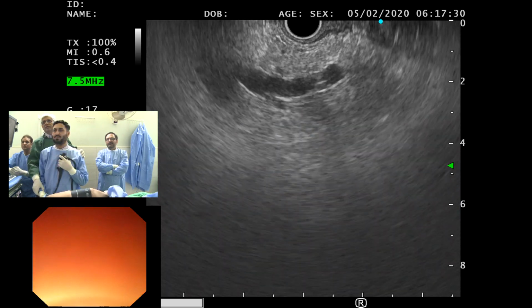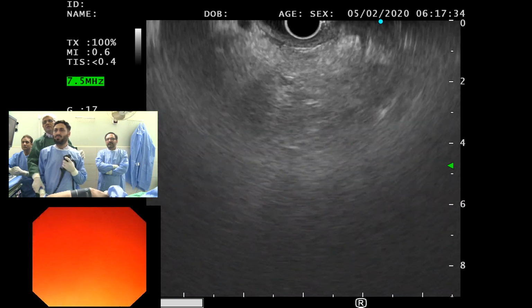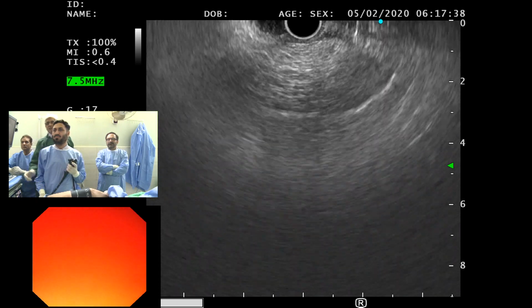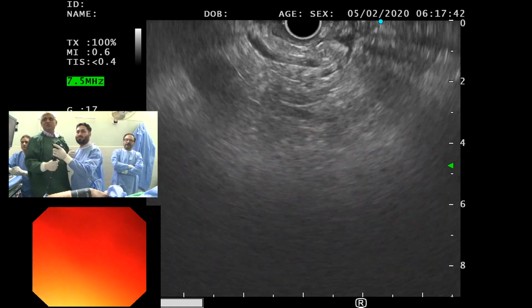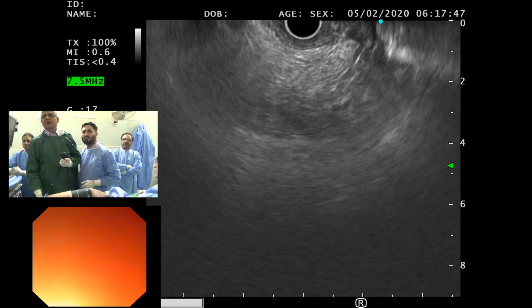Yeah, keep going. Keep going. Back a little bit. You're not seeing that. एक सेकंड दिखाएं, मैं आपको बताऊँ आप क्या मूवमेंट करेंगे तो आपको मिलेगा. Because I'm not sure why you're not getting it. So we'll just go up, tip up it. Okay.